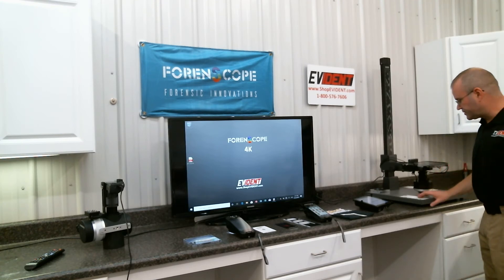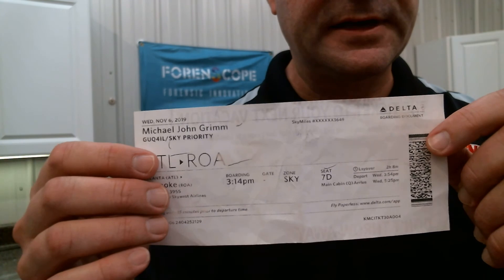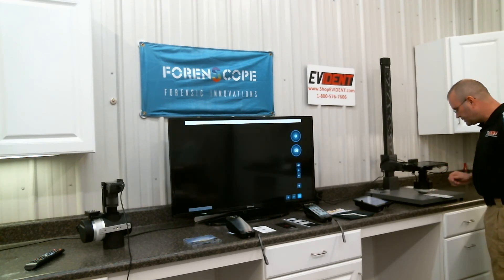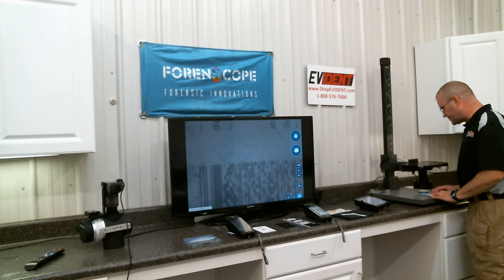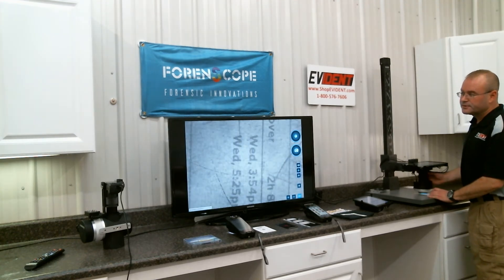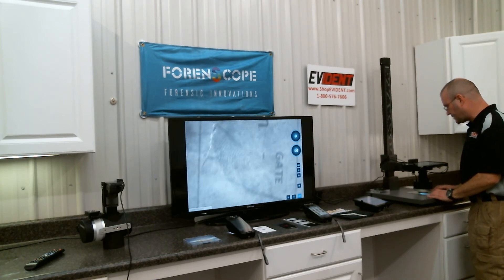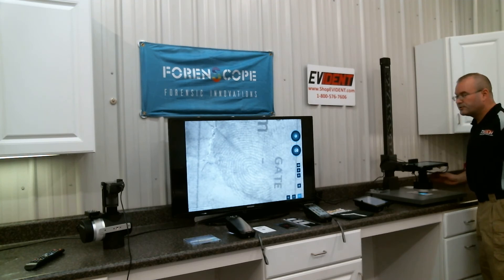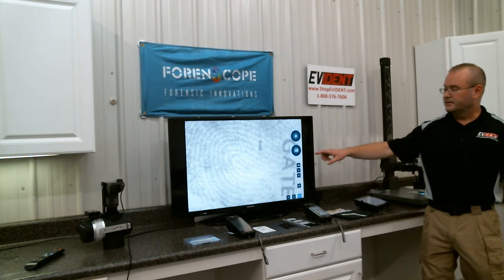Let me give you a quick demonstration. This is a thermal paper receipt — it has not been processed. No chemicals, no dyes, nothing. I'm going to turn on the UV setting for the 4K system, turn on the external battery, and turn on the light. Now I'm going to slide the receipt underneath the optics of the device. I can adjust the aperture to control the brightness and adjust the focus. And this is a latent fingerprint — no prior processing, no chemical development, no powders, no tricks. That is on a thermal receipt. That is a high-quality latent fingerprint.